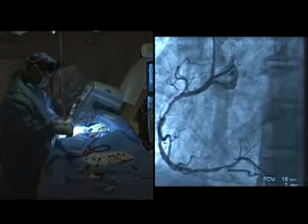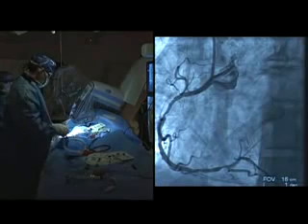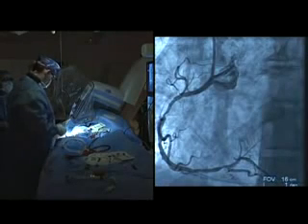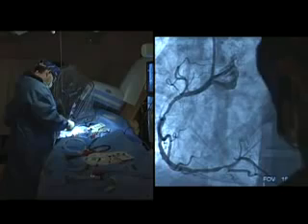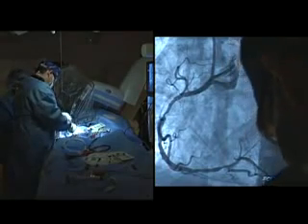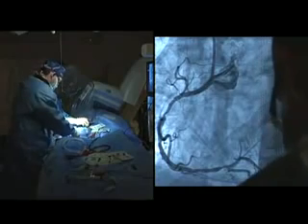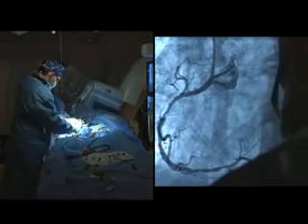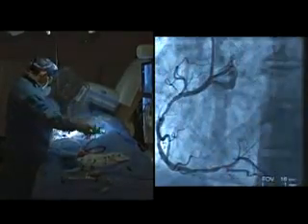So we went in knowing clinically that there was a lot of clot in there, even though we couldn't see it, and used the clot removing device before we got started. If you don't do that, you can really get into a lot of trouble with the vessel and have a very difficult time opening the vessel if you don't first remove thrombus. So we made several passes with the thrombus removal device called the export catheter, and actually had a very nice result. And now we're going to finish the procedure by stenting.